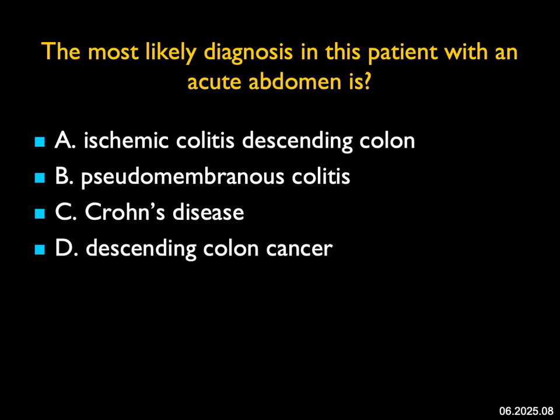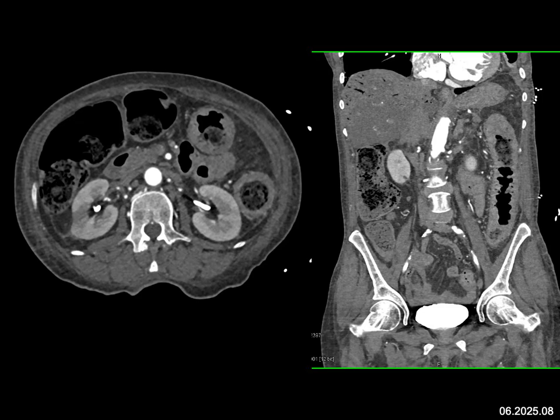The most likely diagnosis in this patient with an acute abdomen: I see marked thickening on the axial view of the descending colon, pretty extensive from the level of the splenic flexure down through the descending colon — and we're probably not seeing the full extent of it. It does not have the irregularity of pseudomembranous colitis. It doesn't look like Crohn's disease, and it doesn't look like a cancer. Rather, it looks like inflammation — inflammatory, ischemic, or otherwise. The best answer that matches is ischemic colitis of the descending colon.